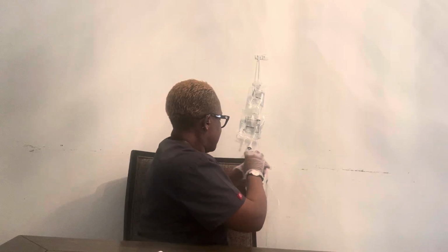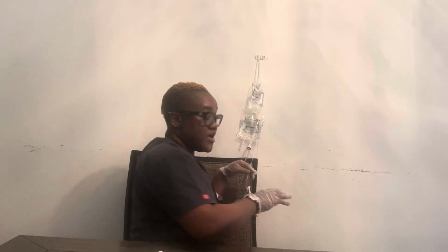Okay, so I have counted the drop rate, and we actually have 133 drops per minute.